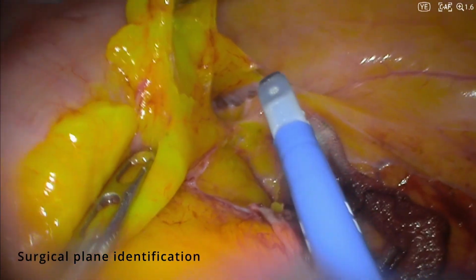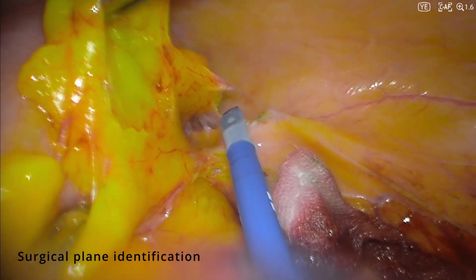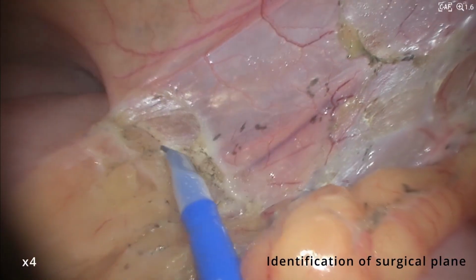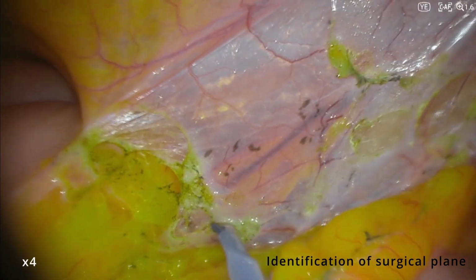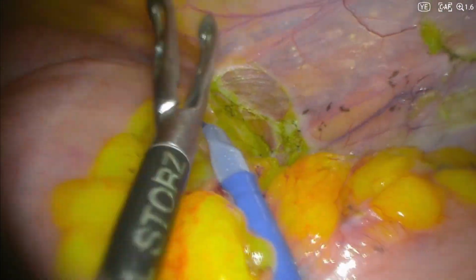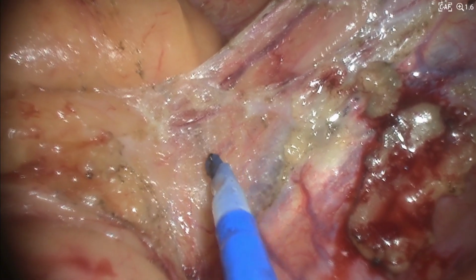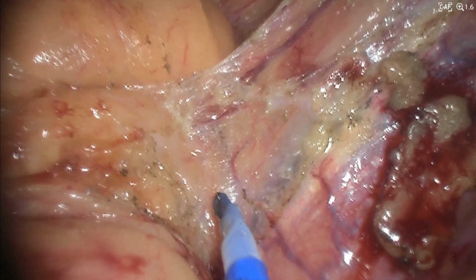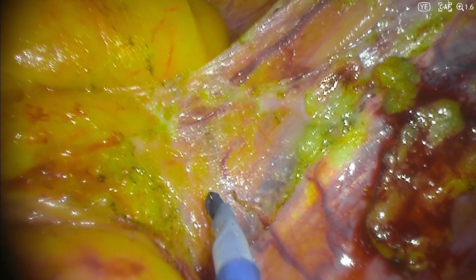Here we see a clear distinction between the avascular plane and the two fatty tissue. This enhancement allows for dissection closer to the bowel wall, resulting in lower risk of injuries to other structures and vessels. Misrecognition of planes can result in visceral, vascular, or peritoneal injuries or bleeding in obese patients who typically have thickened mesentery with more adipose tissue. Therefore, having an improved visualization and distinction of surgical plane is helpful for more precise dissection and reducing blood loss.